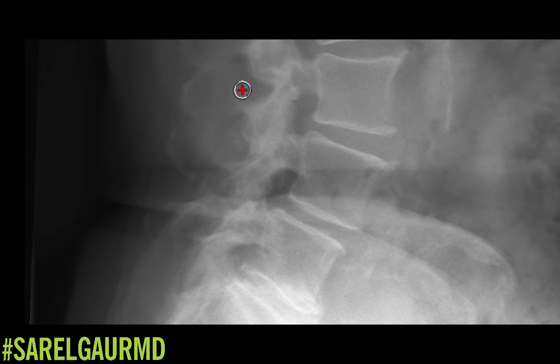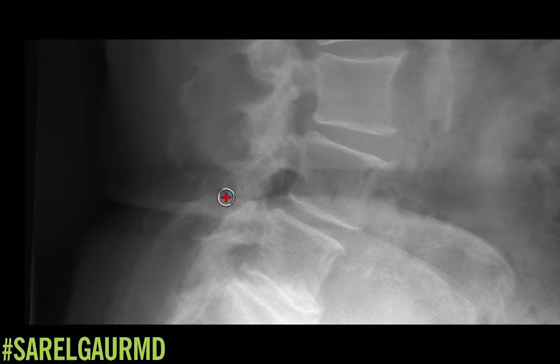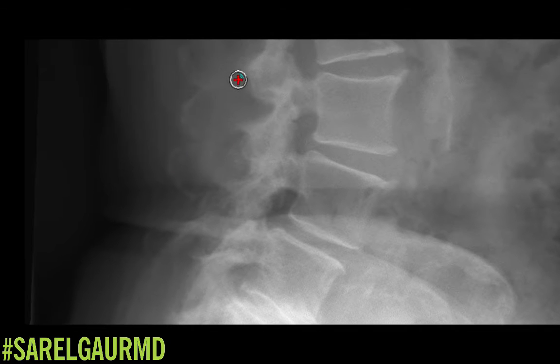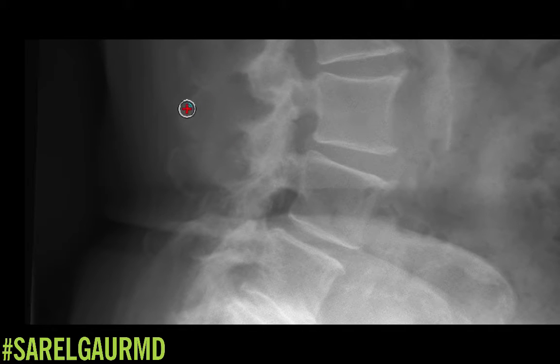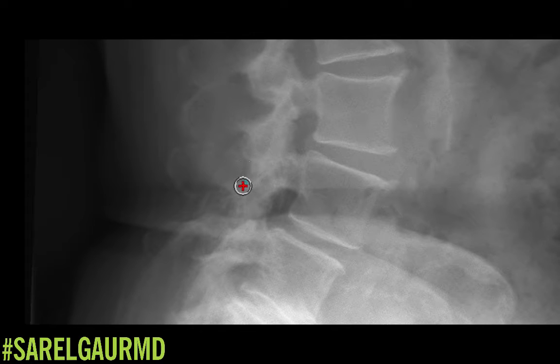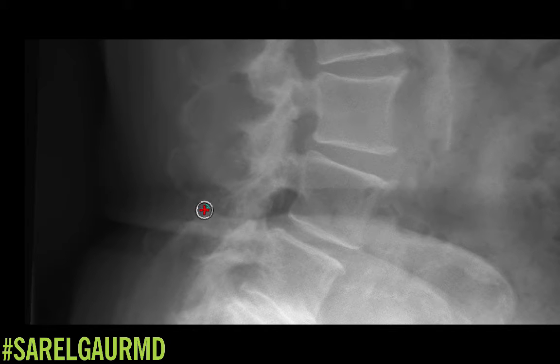Moving further back, I look at the spinous processes. You can notice how these spinous processes are basically kissing each other — they're enlarged. This is a condition known as Baastrup's disease. This can limit movement; basically it can decrease extension. That's something I think worth mentioning.